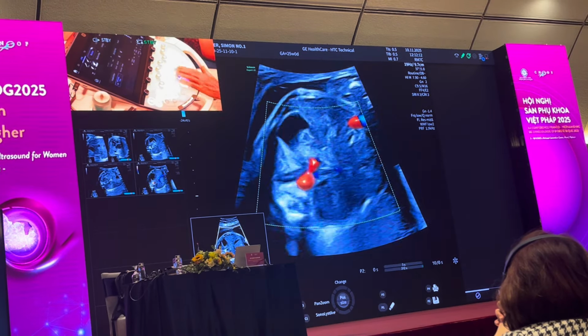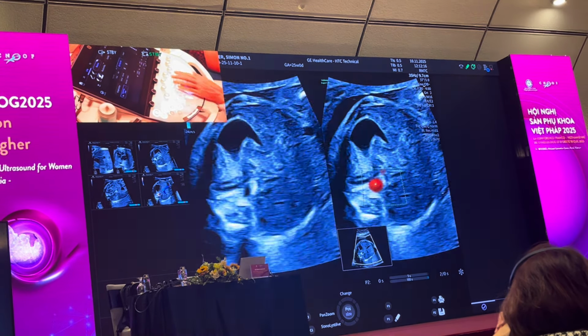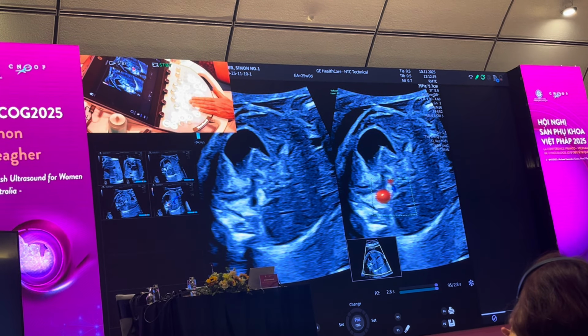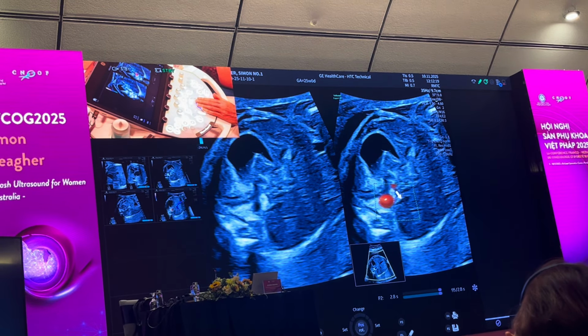This is normal. When I look at the aorta and the IVC and split my image in two, I can see the fill of the aorta, but the IVC is not filling, because my PRF is at 24 centimeters a second in the top left-hand corner. This is the IVC here.